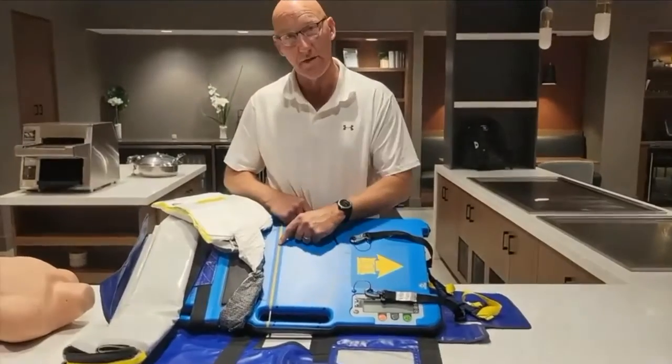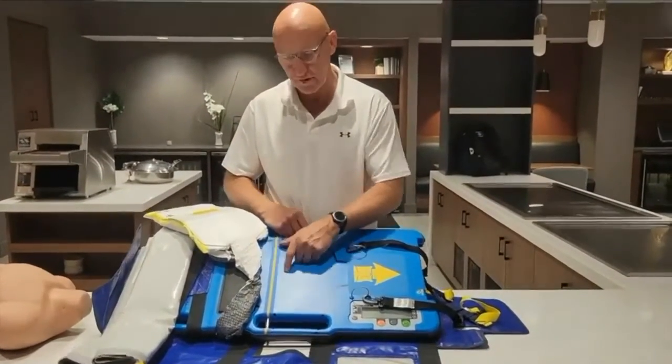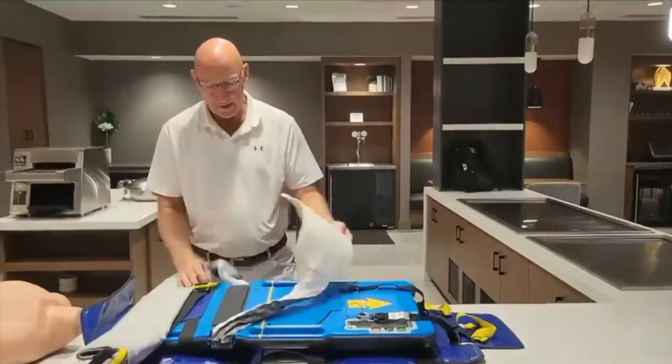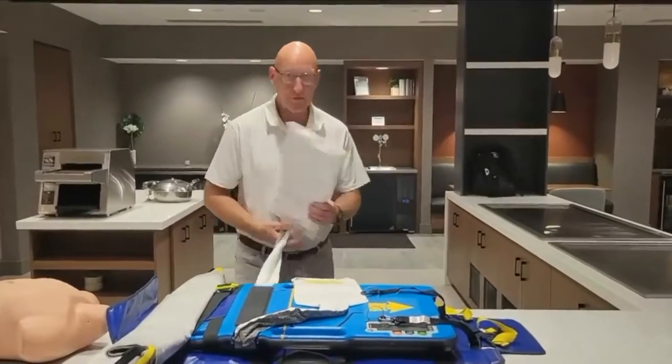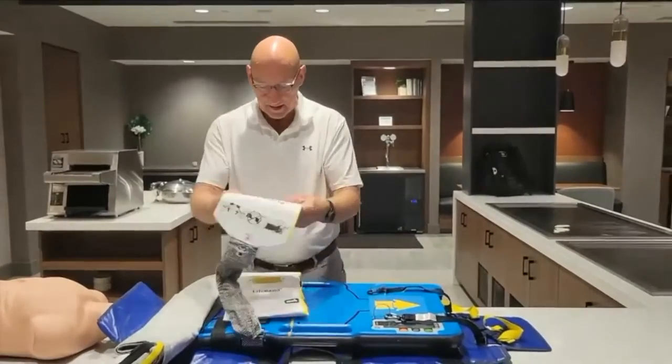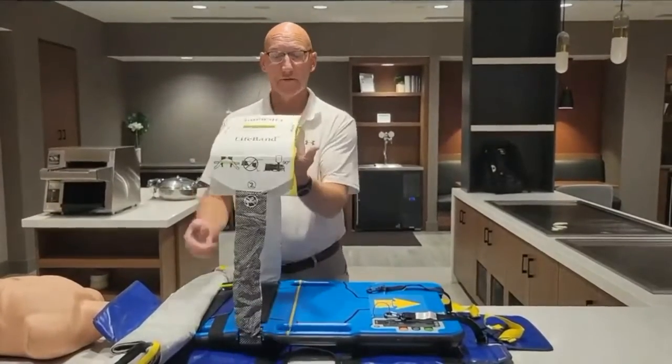The only alignment marking on our platform is this yellow line, which should fall in the armpit of your cardiac arrest patient. That would then match up with this load distribution band that also has a yellow line on it. So as you're placing this on top of your patient's chest, this band should be at 90 degrees.